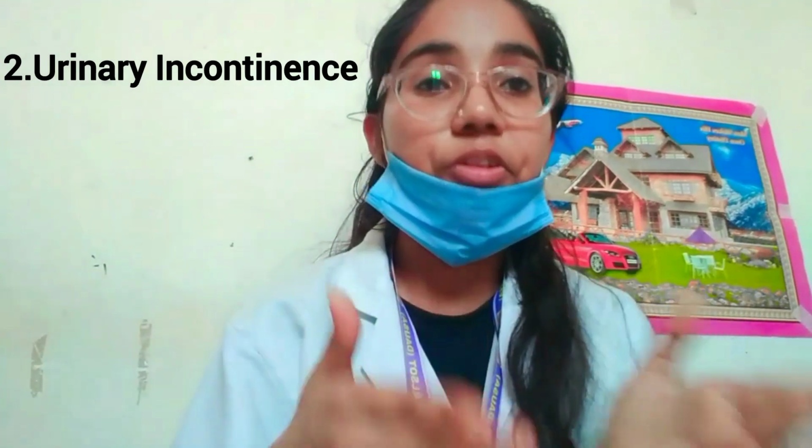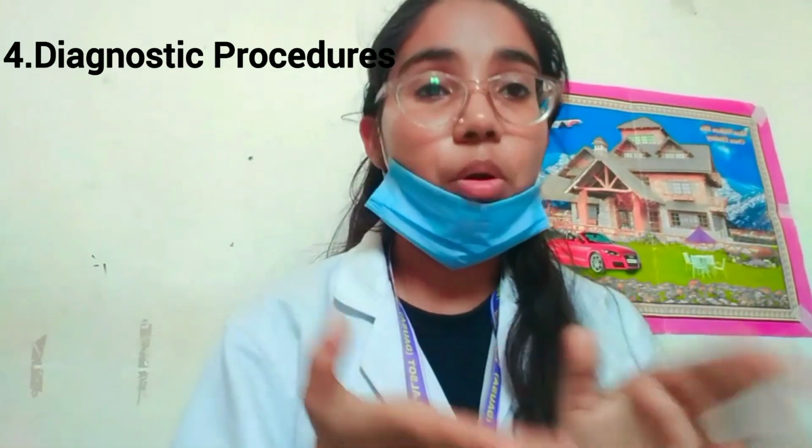In these conditions, urinary catheterization is performed. First, urinary retention, inability to urinate. Second, urinary incontinence, loss of bladder control. Third, monitoring urine output. Fourth, diagnostic procedures. Fifth, surgical procedures.